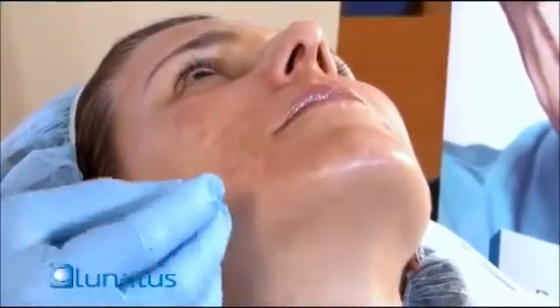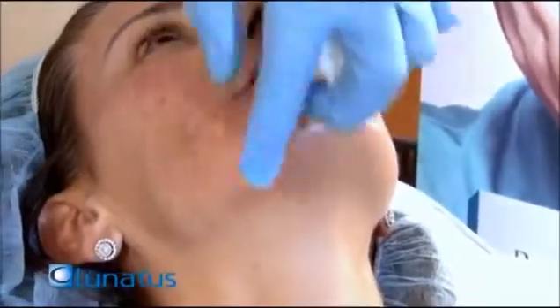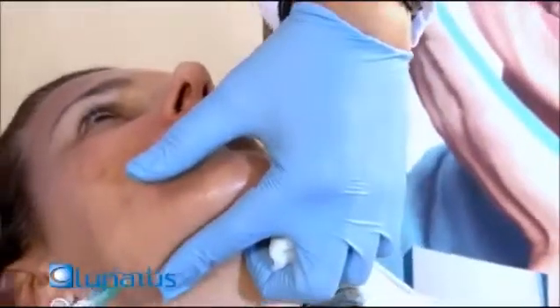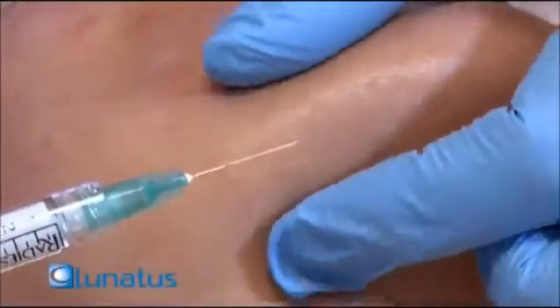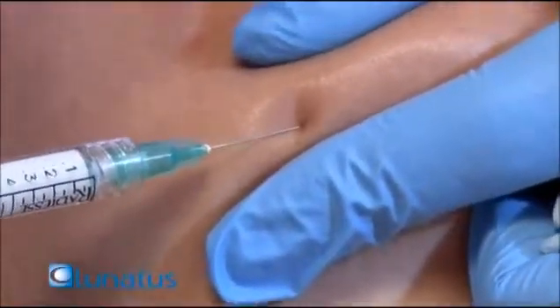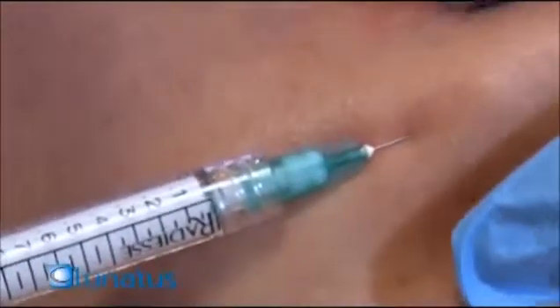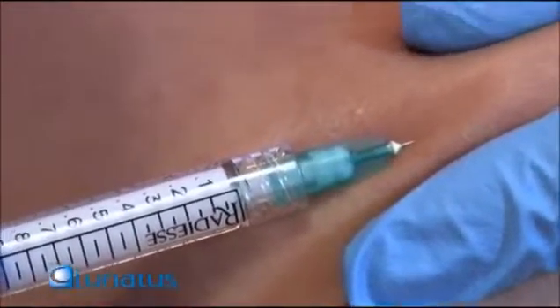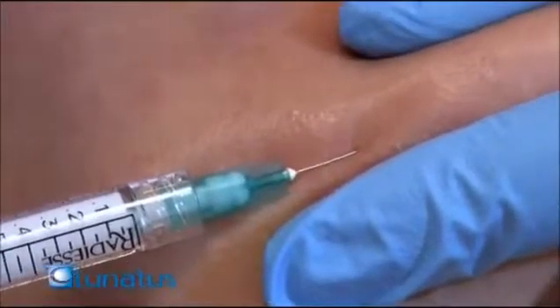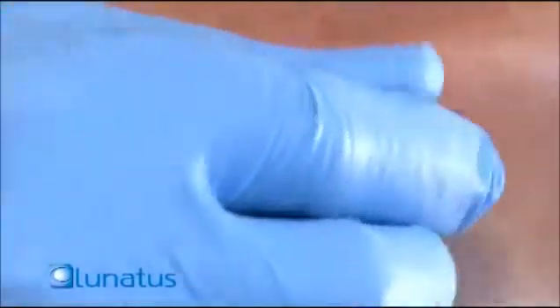This area can be treated — we've already made it less prominent by injecting the temples and the cheeks. Now we're going to inject this area to complete the picture. I place my non-dominant hand parallel to the mandible and inject quite parallel but on the deep side — very very deep. It's very important to inject as you go in because there is a large artery, a large vessel right over here, that if nicked will cause a lot of bleeding and bruising. We want to try to avoid that. We've injected about 0.4ml mainly on this side, and you can see it's giving her that chiseled look compared to the other side.